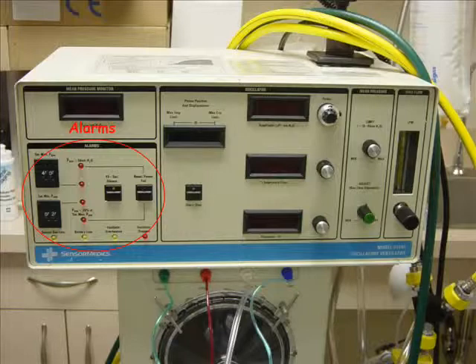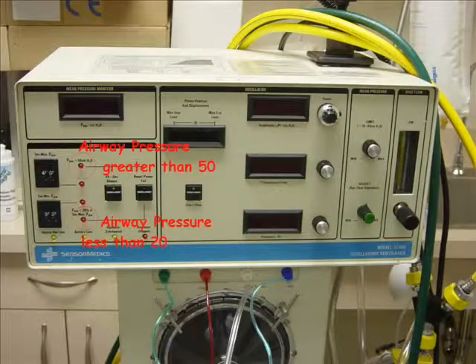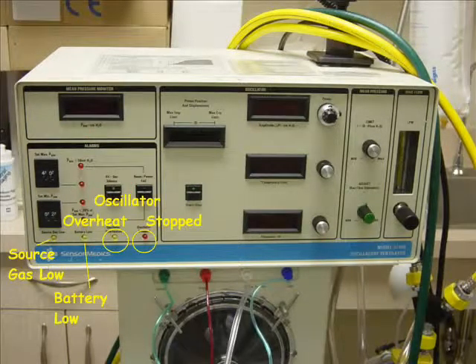Let's take a look at some of the alarms on the Sensormedic ventilator. First, we have the adjustable set max airway pressure and set minimum airway pressure, each having a red indicator light when it's been violated. We have a preset high pressure of 50 and a preset low pressure of 20 with red lights for each of them. Then we have a silence button of 45 seconds and a reset power button fail down there, as well as 4 indicator lights. The source gas is low, the battery low, the oscillator overheat, and the oscillator stopped, which is a red button.